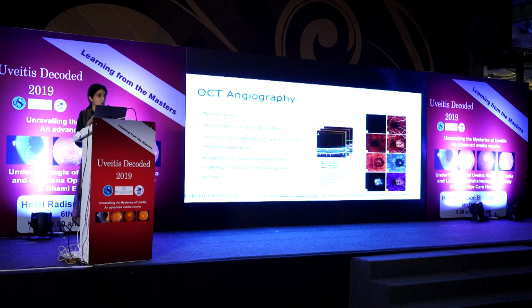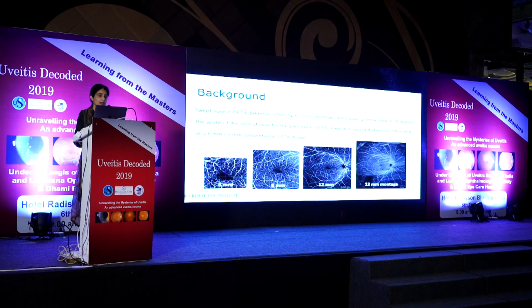So then came these non-invasive OCT angios that offer you in vivo layer-to-layer dissection. But the major drawback so far was that there were a lot of artifacts, very limited view, and the inability to visualize your peripheral retinas. And then came these swept source Plex Elite models that are now offering you a 12 by 12 mm montage as compared to the standard 3 mm or 6 mm scans. You can see up to 70 degrees of your retina, which is 9 times that of what a 6 mm scan is showing you.